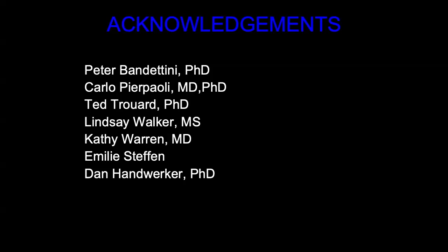Yeah, so as part of my job as staff scientist in the center, I often consult for people when they want to come do a diffusion experiment. We typically start with, what kind of question are you asking? Depending on the question, you might need a certain representation of your data, and from that, how do we collect that data? How much do you need? If you want to just do DTI mathematically, the minimum is 6. But other published papers show that to get a nice representation of the direction for brain tissue, you need at least 30 directions.